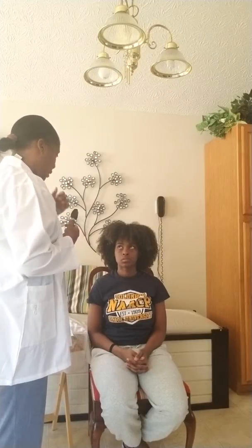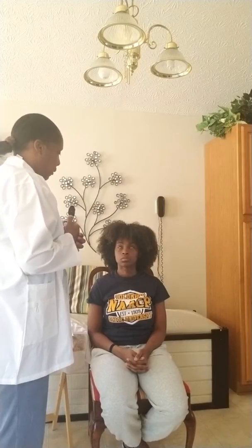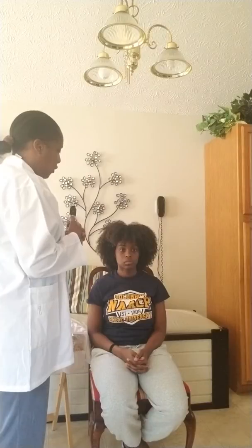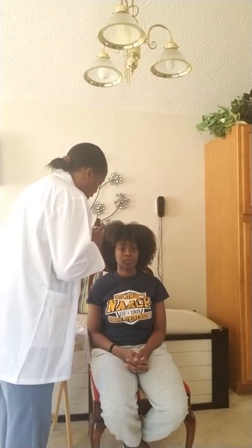What I do is I'll look into your eye. I'm going to look to make sure all your blood vessels and your optic disc and your optic nerve are intact, okay? If you'll look ahead for me and try to keep your eyes, if you can blink through the test, I've got to find my spot. You always start on 0, and then you can adjust the dial, anybody can adjust the dial to how they want it. I'm going to come in at a 15-degree angle. I'm going to put my hand on your shoulder, okay?